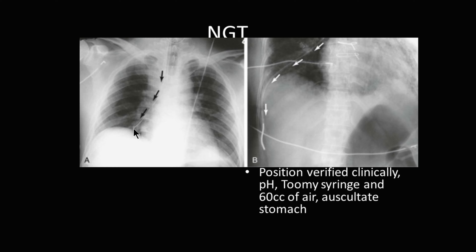This tube needs to be pulled and placed correctly. If you keep pushing, the NG tube can pass through the right main stem bronchus, into the lung, through the lung, and then into the right-sided sulcus. This becomes a problem because the NG tube has broken its way through the lung and is penetrating into the space between the diaphragm and the chest wall. This is dangerous and could cause a pneumothorax, so this NG tube should be pulled and replaced.